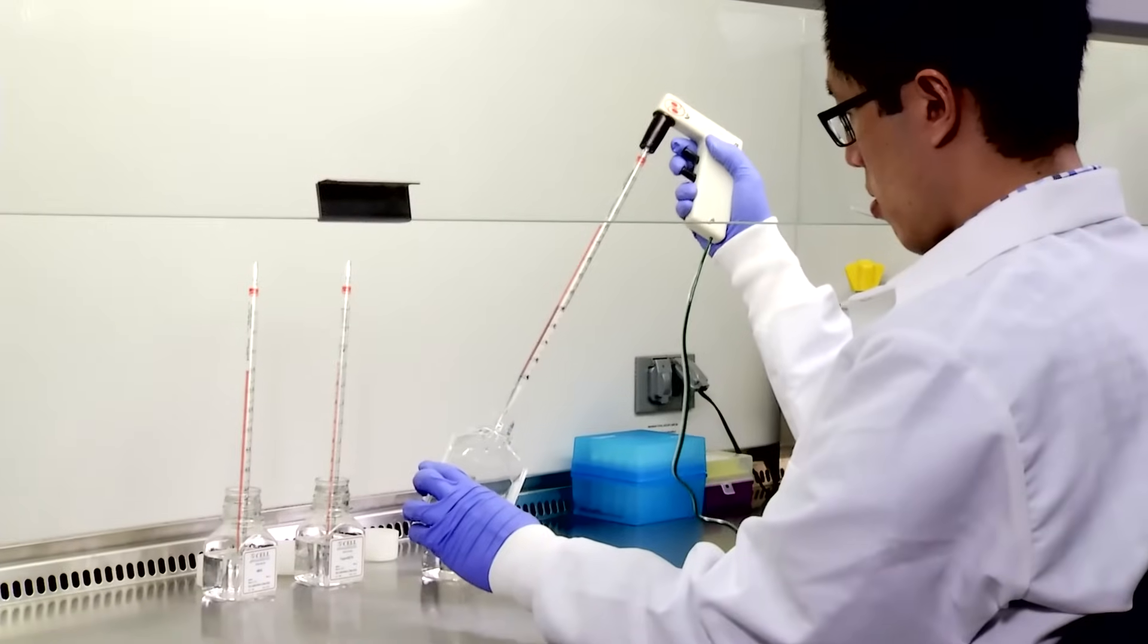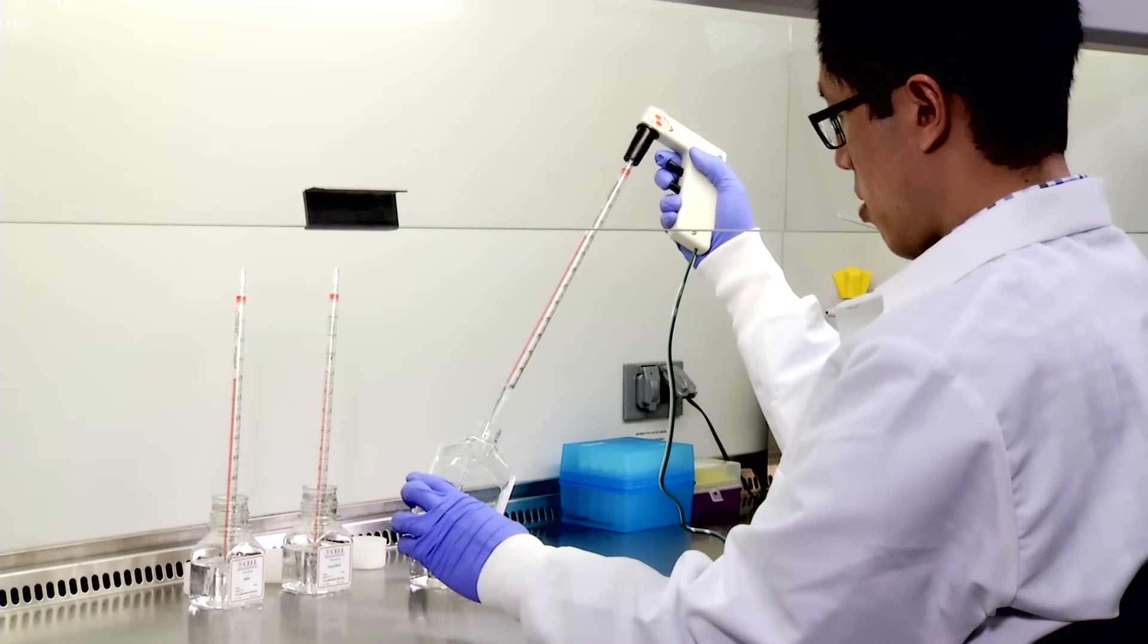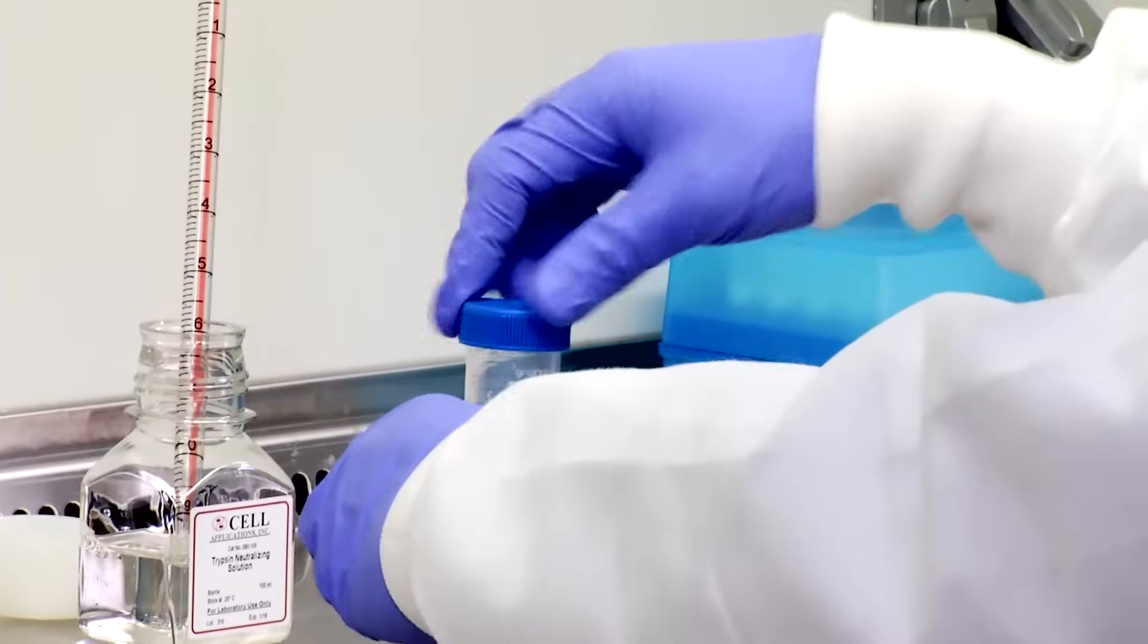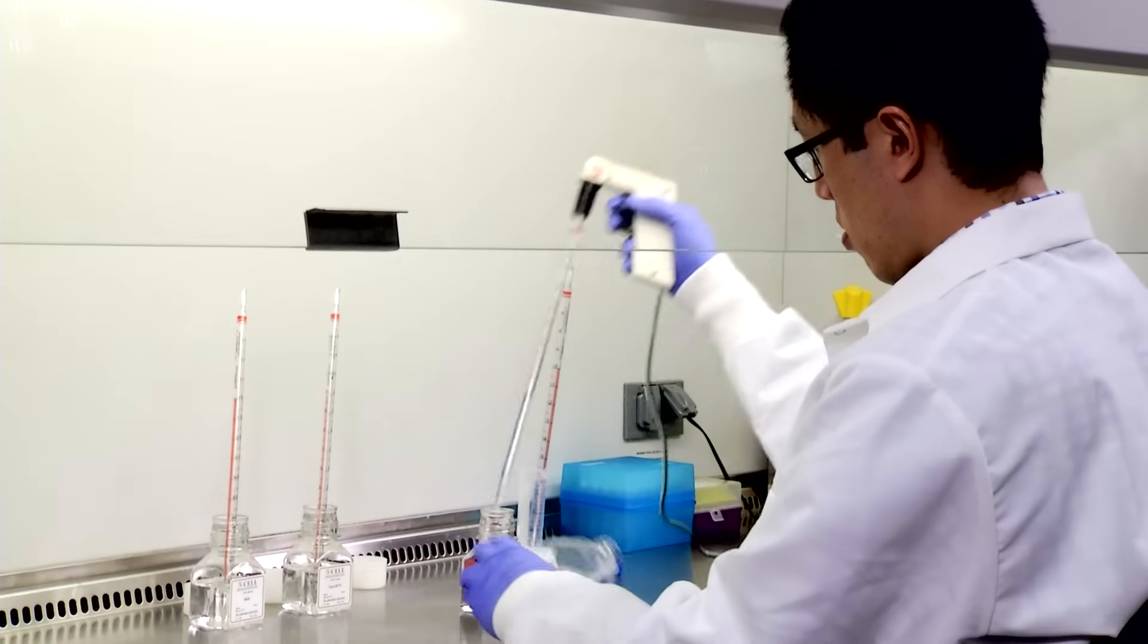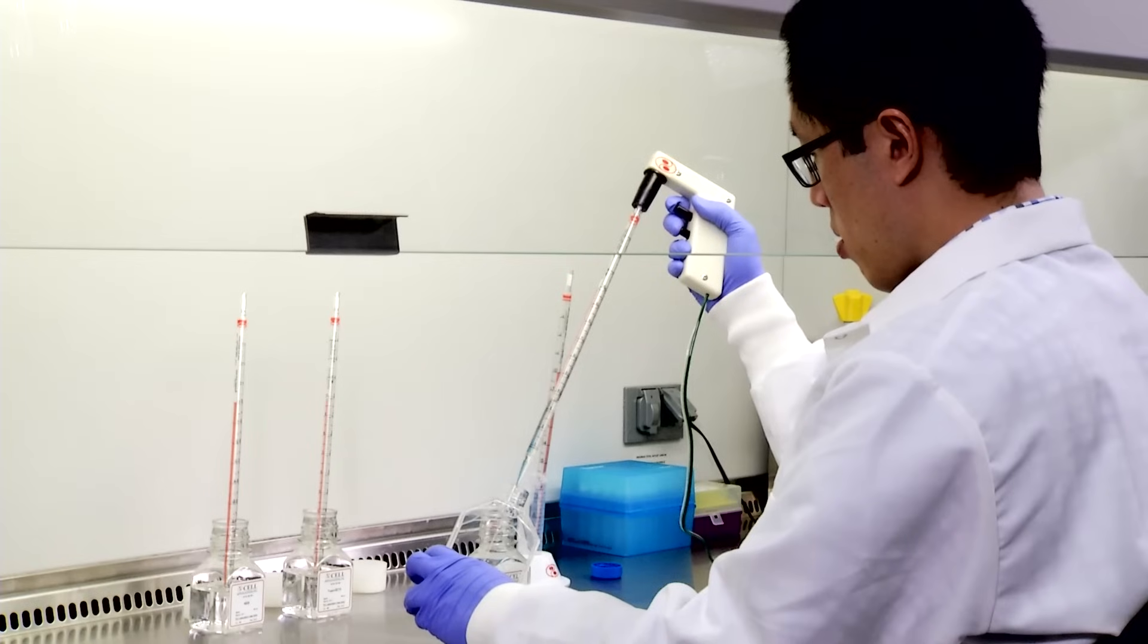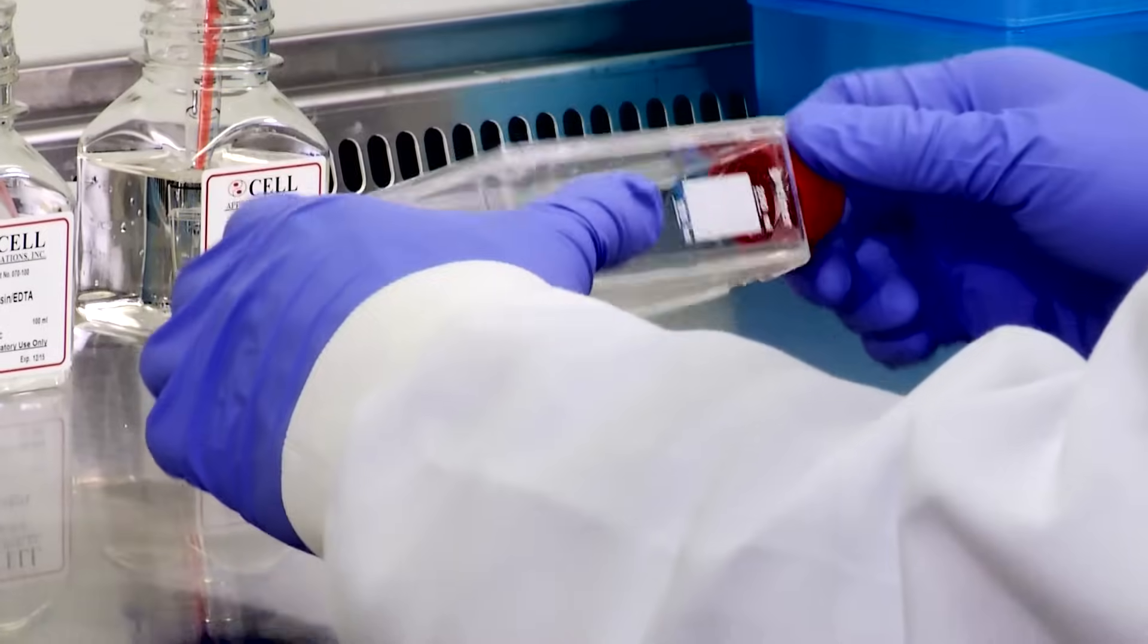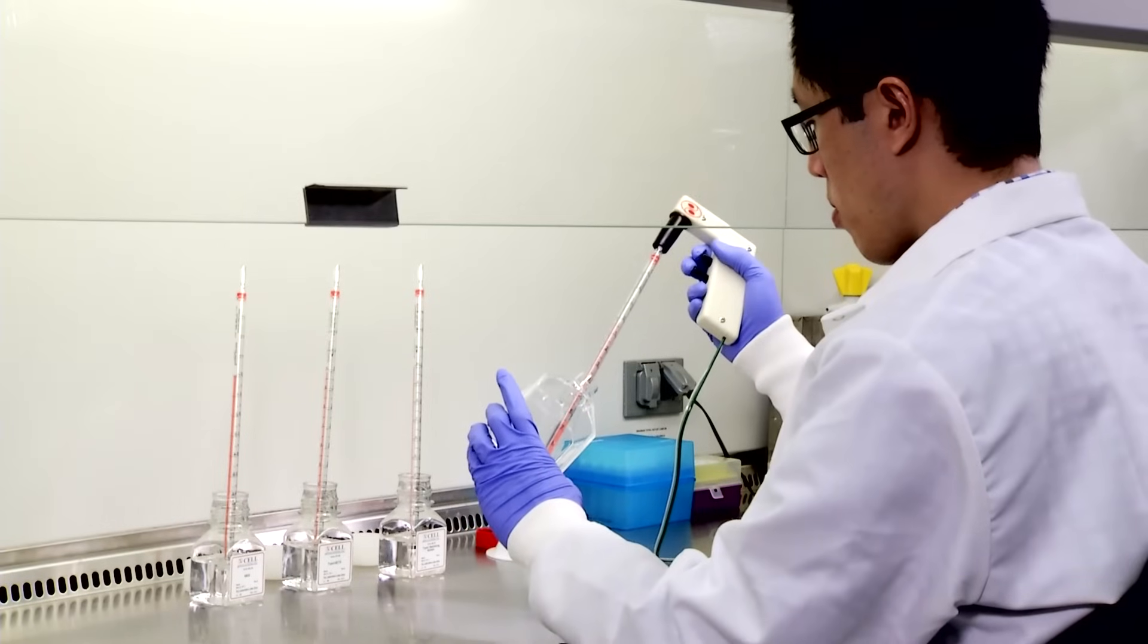Add 5 ml trypsin neutralizing solution to flask. Transfer cell suspension to sterile 50 ml centrifuge tube. Add another 5 ml trypsin neutralizing solution to flask. Rock gently and transfer remaining cells to same tube.